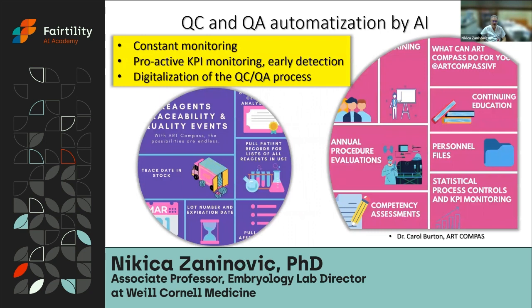So to start with, any IVF lab knows that we need to start with the basics, which is quality control and quality assurance. And how do we see that AI can influence that part? Well, AI is going to be like a big eye monitoring everything you have in the lab. Nowadays, every single machine, every single instrument in your lab has to be on some kind of alarm system, which is monitoring what's going on with that particular instrument.